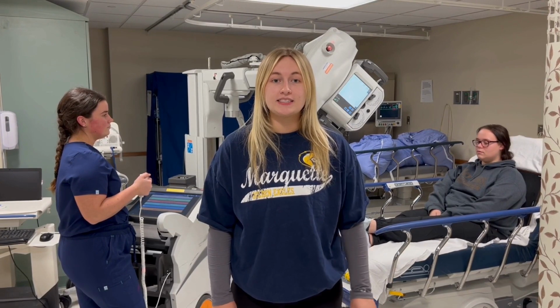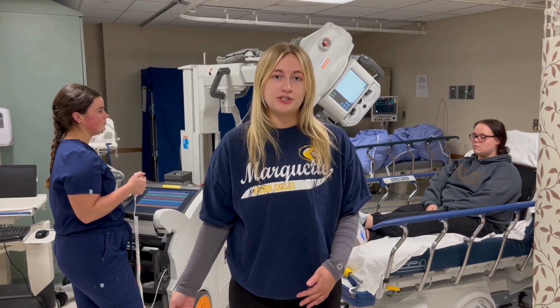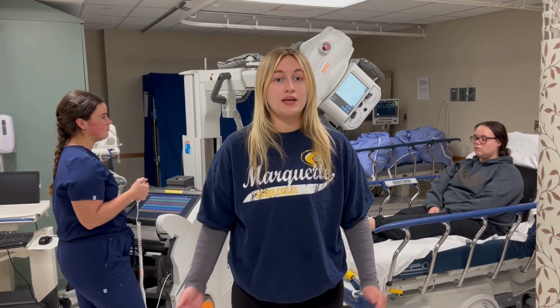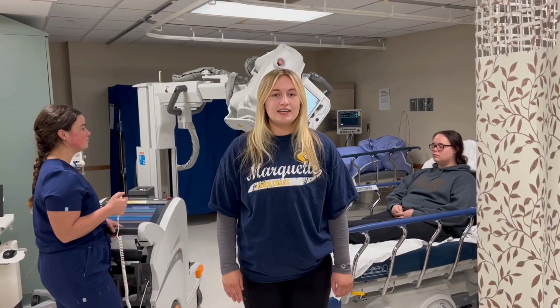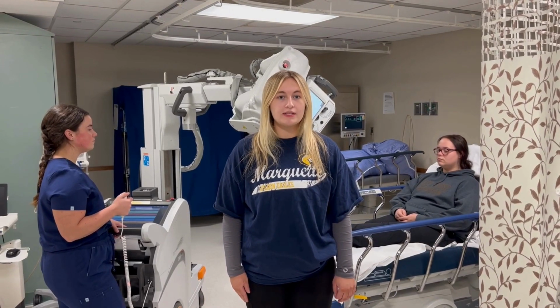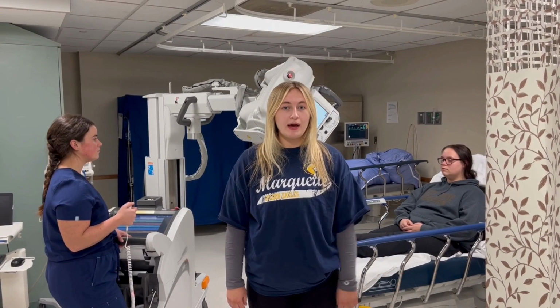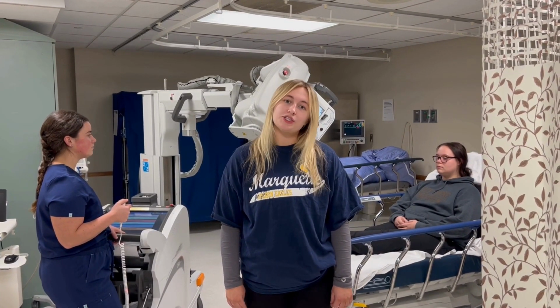First, she did not ask the other person in the room to step outside to reduce and prevent radiation exposure. Second, she did not step at least 6 feet away from the patient to reduce radiation exposure. Technologists should consider radiation protection for everyone. The walls of the room are considered primary barriers to X-rays. Having others in the room step out can help prevent radiation exposure.